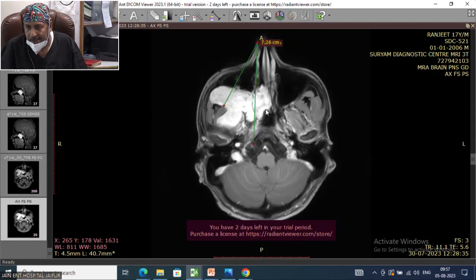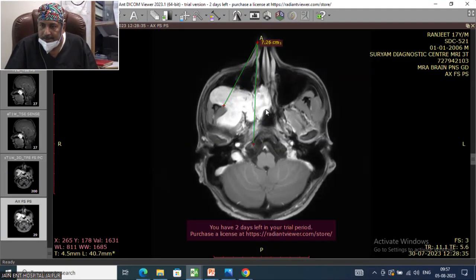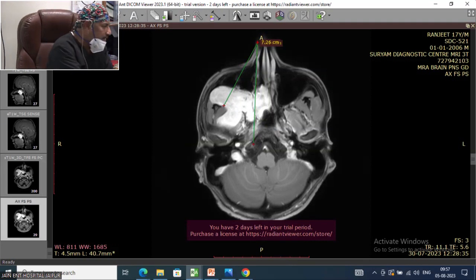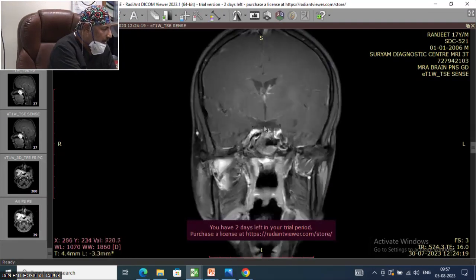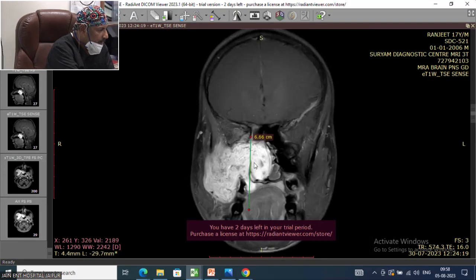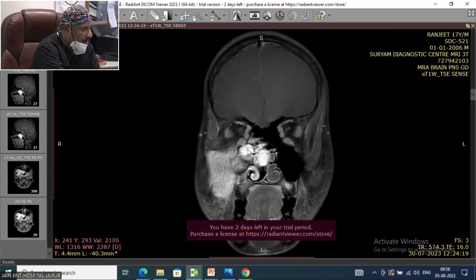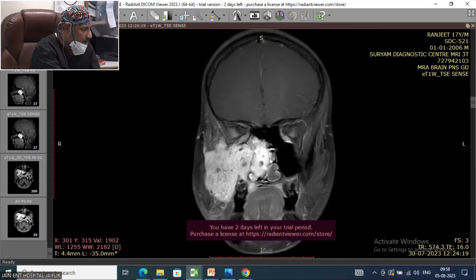It is pushing borders everywhere, pushing borders towards the muscles in the infratemporal fossa, towards the orbital fissure, towards the cavernous sinus. Everywhere is pushing. So we have to remove. We have to completely remove the pterygoid on this side, and this tumor is completely infiltrating the pterygoid from top to bottom. See this pterygoid from bottom to top, completely infiltrated by the tumor here. That has to go completely. We will drill away and remove this tumor.